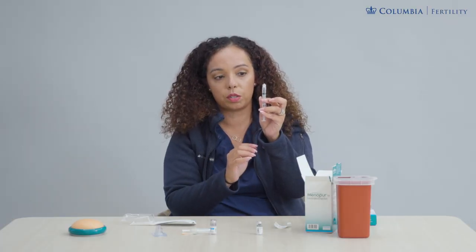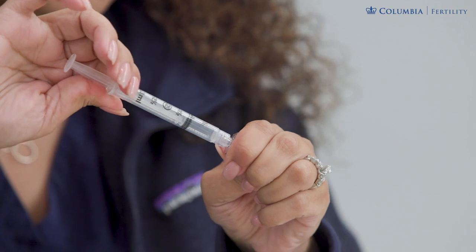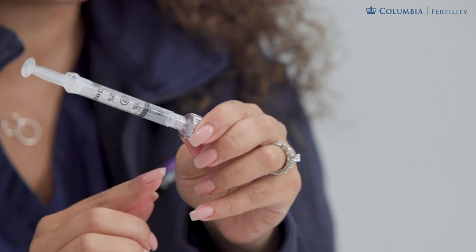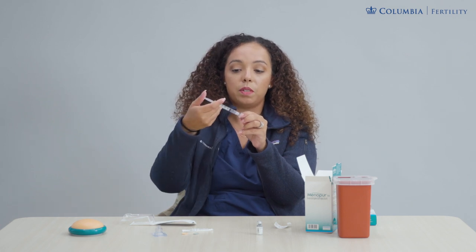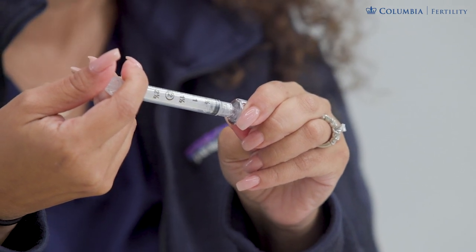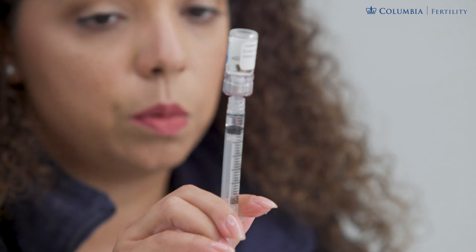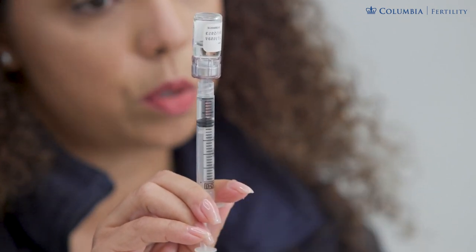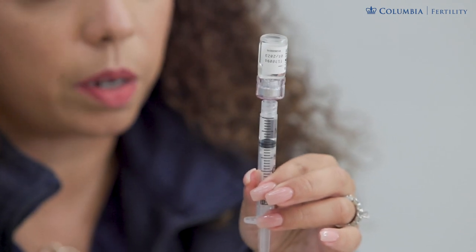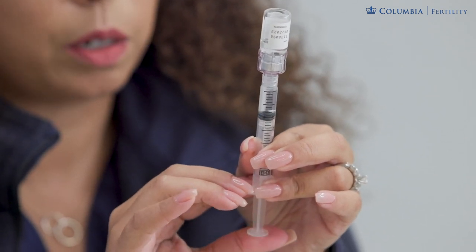Attach your syringe to the Q-cap by screwing it on nice and tight. Always make sure your connection pieces are nicely secured because if they are not, you will lose medication within your connection piece. Next, push in the air, which creates enough pressure to allow the fluid to drip out of the vial. Invert the vial to the ceiling and release your plunger — you will notice the water starts coiling in on its own. Pull down further than the one milliliter mark and then push back up to the one line to adequately fill the syringe.